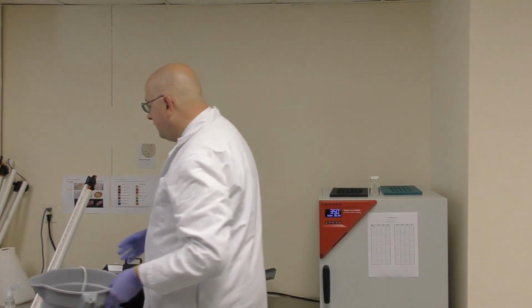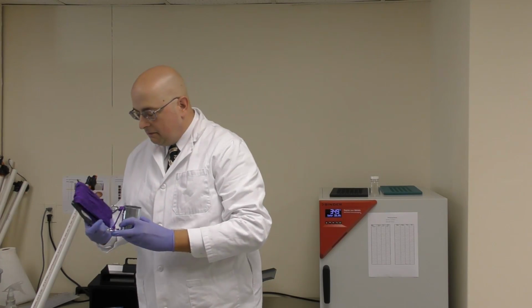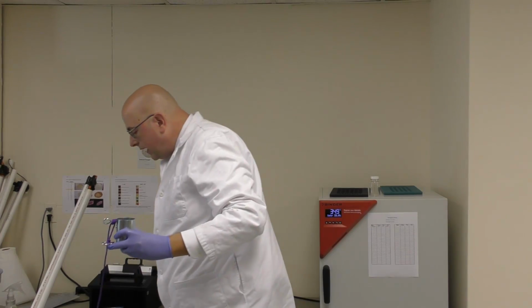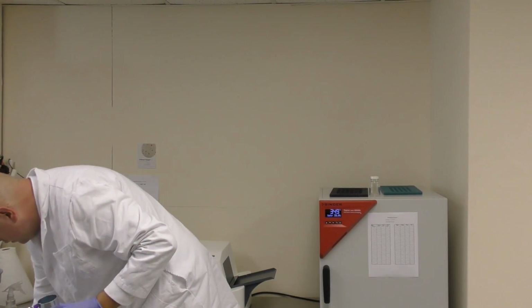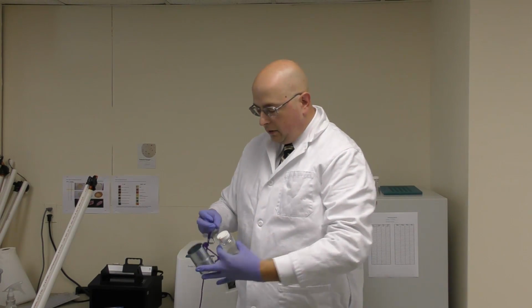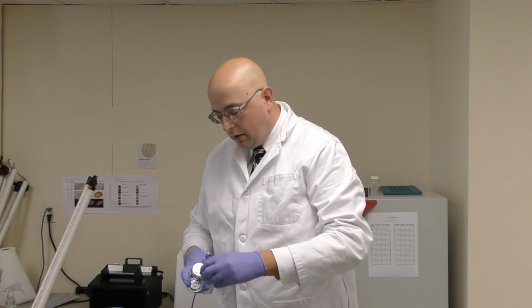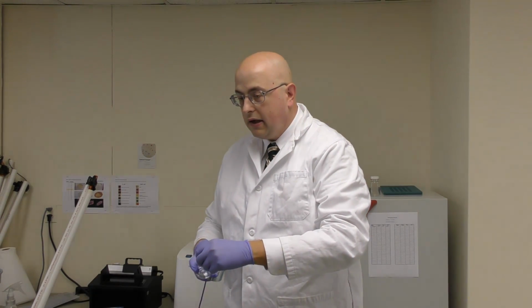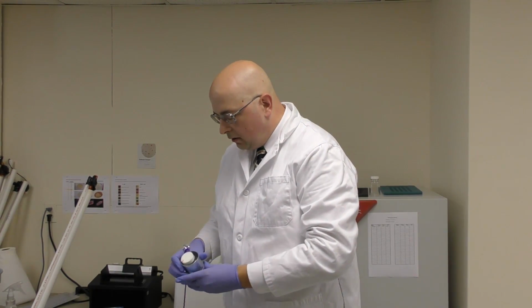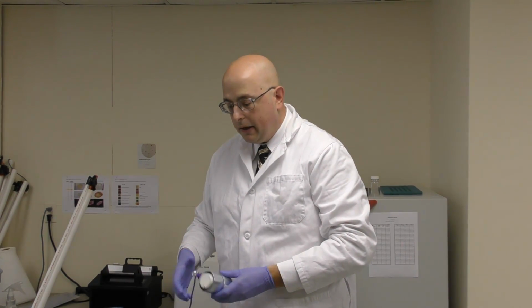Now, instead of using a bucket, what we've created here is a sampling device where you're still collecting the sample directly into your bottle. Basically the way it works is you take your bottle, and you'll notice the bottle has a little plastic ring that you can remove, so it's kind of like a seal. It's a sterile bottle, just like your old ColiScan bottles are. You put your bottle in there, and then you just twist this a little bit to lock it in place. It's not going to come out.